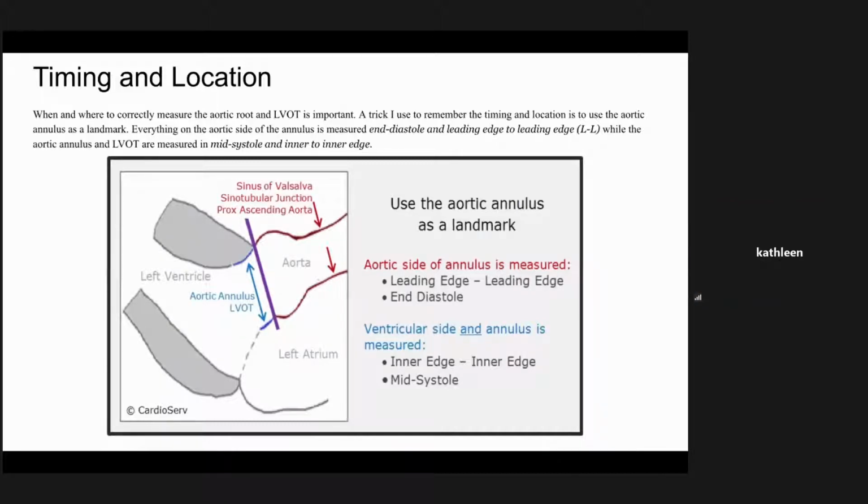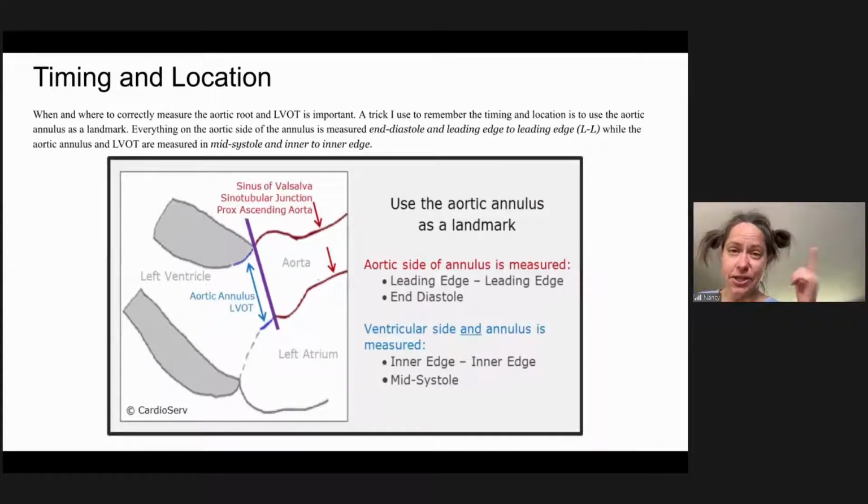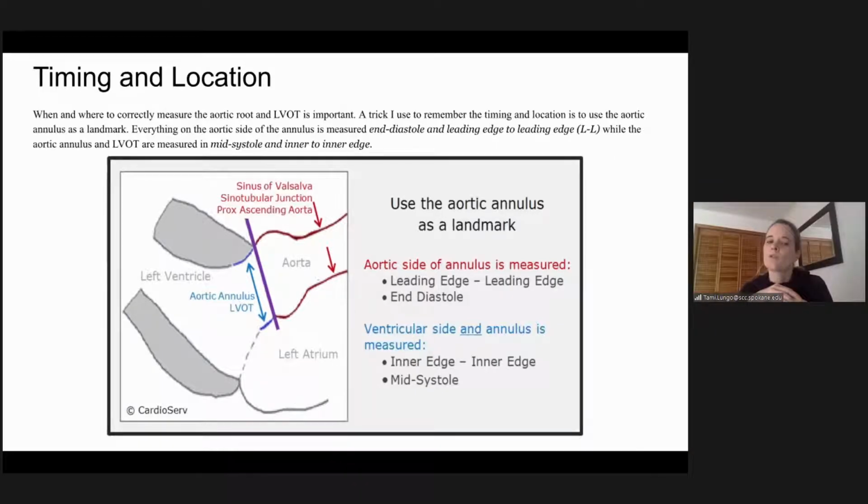So you're measuring before the turbulence for your diameter, not where the turbulence is, and not after, but before. Yes. One more piece to add on to make sure I'm clarifying everything: aortic stenosis will cause turbulence before the valve, more so the more severe the stenosis.